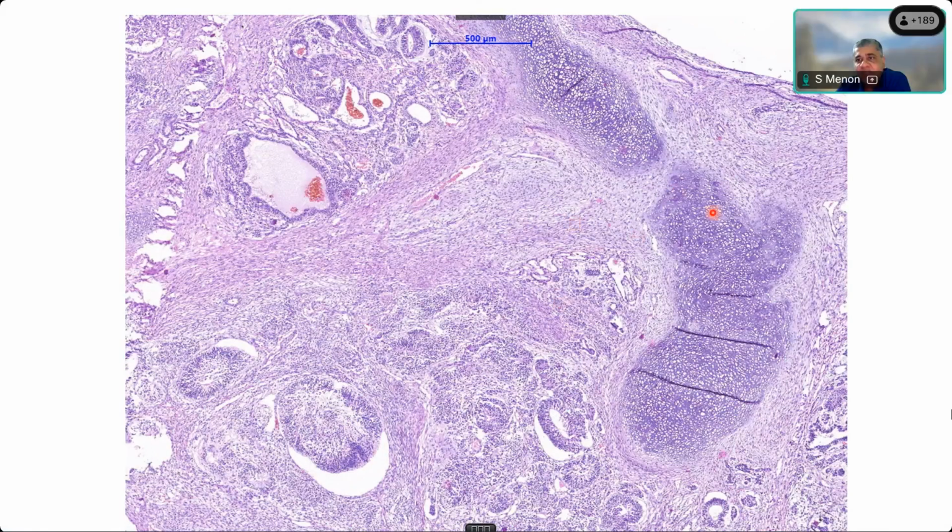What about this one? Somebody said squamous cell with keratin. What is this blue? I see a histology slide under the microscope, and it looks like cartilage. Yes. It does look like cartilage. Very nice. So there is cartilage, there is chondroid material, and then you have this immature neuroepithelium. You see this very beautiful immature neuroepithelium.